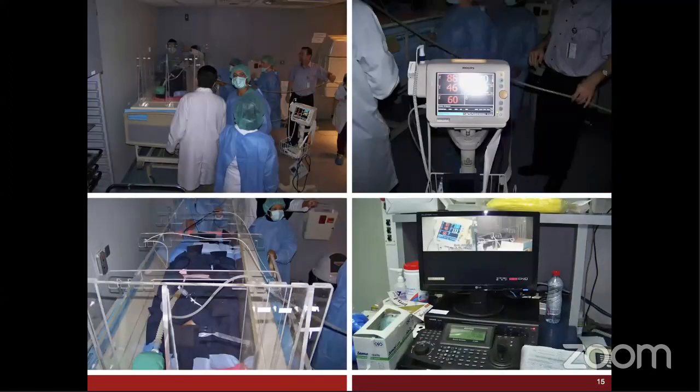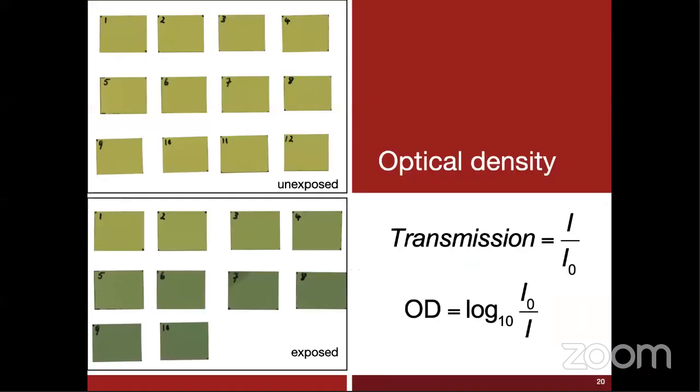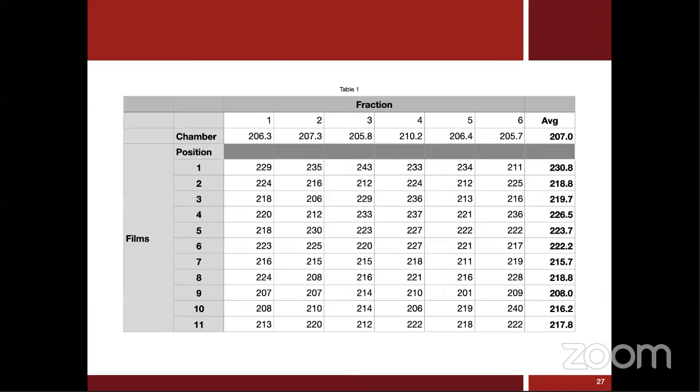The uncertainties have a lot of factors in them, not only on the dosimetry part, but also on the bolusing, how this is placed. And sometimes in one fraction, 2 pieces or 2 bags could be actually not positioned properly. So there is less attenuation. That's why the film is getting more dose and so on.